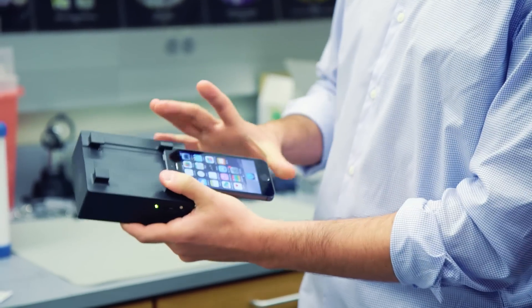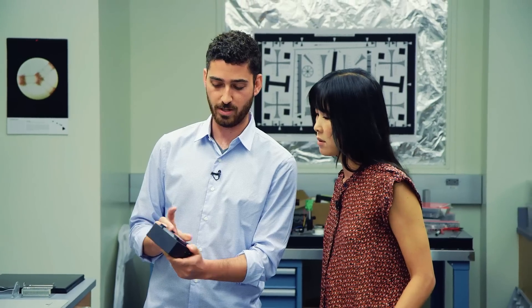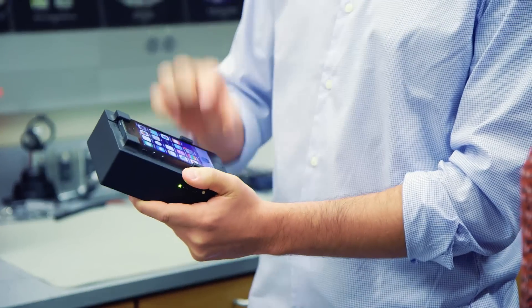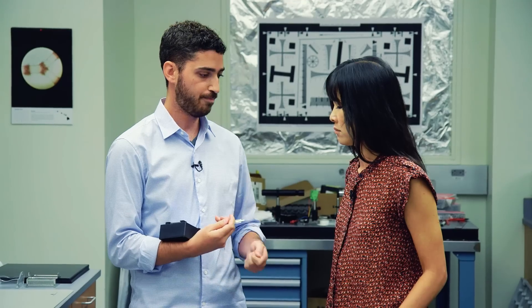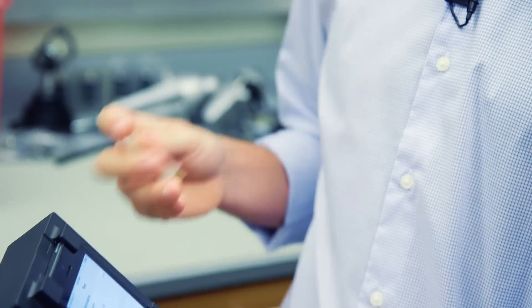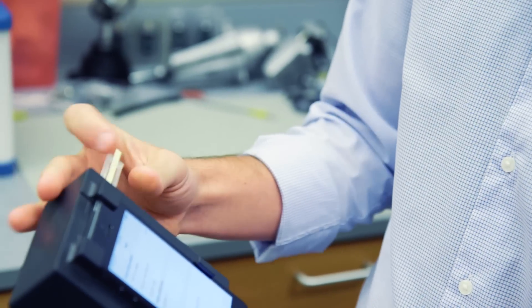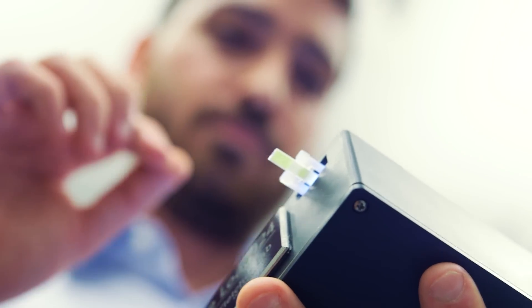So the way this works is you slide the phone into the holder here, and then we run an app, just like you would if you were loading up Facebook or Gmail. The operator would take somebody's finger, prick their finger, and then load a small volume of blood directly into this glass capillary. Then all you do is you insert this into the side of the device, and you can begin a test.